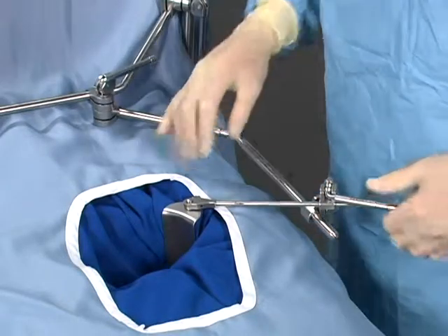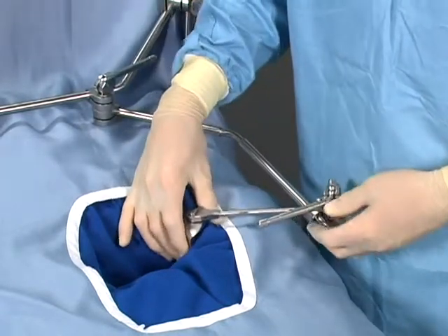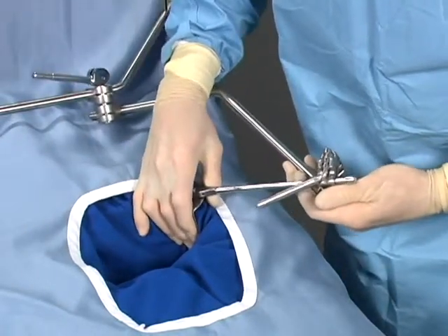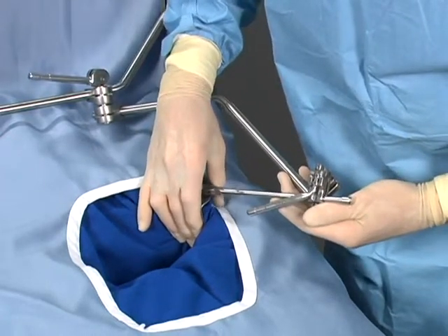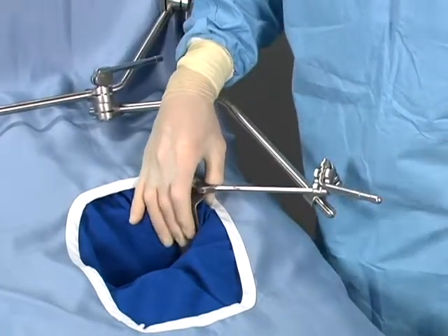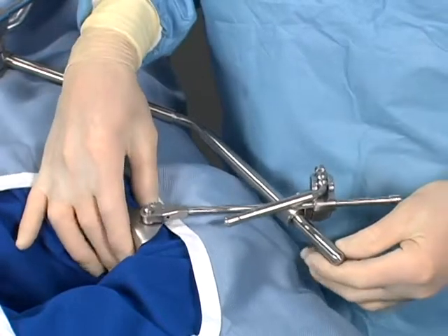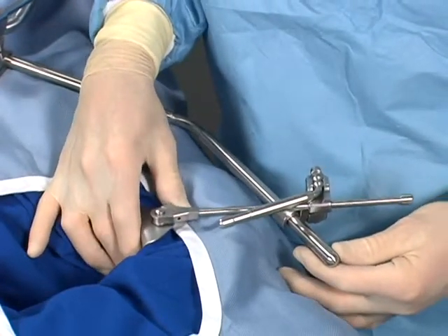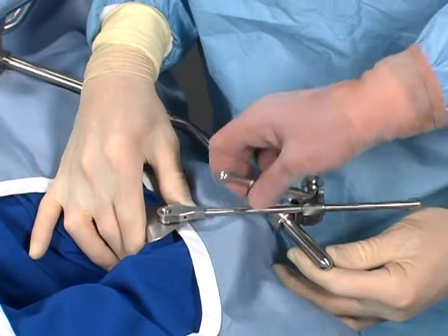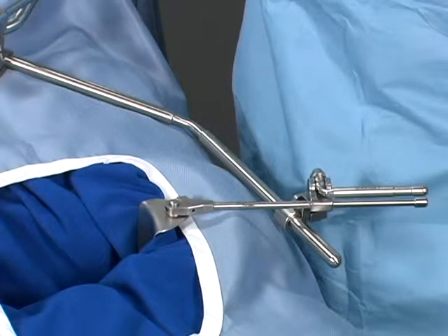Unlike other retractor systems, the Thompson retractor system provides even more precise blade placement. The crossbar and extension arm may be adjusted independently. Have your assistant loosen the extension arm's joint while you simultaneously position the retractor blade and arm — exact placement can be accomplished this way. Once the blade is in position, lock the frame joint and retractor joint. Notice that the frame has a spring-like flexibility, which is an important function when attaching blades. The spring tension of the frame can be utilized by compressing it toward the incision while retracting the structure. When desired exposure is obtained, your assistant tightens the universal joint, and the spring of the frame holds the blade exactly where you want it.